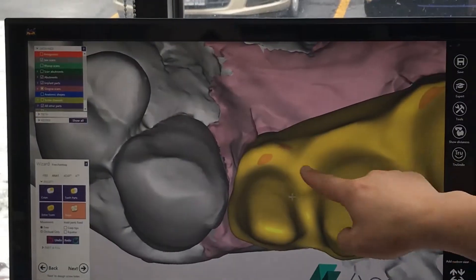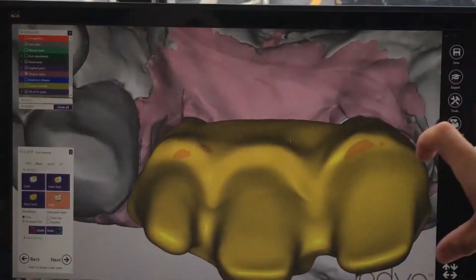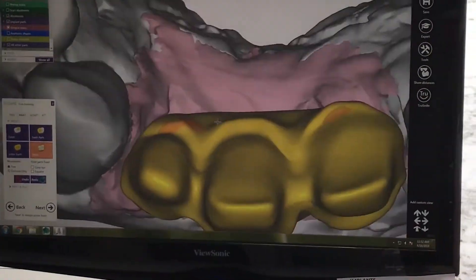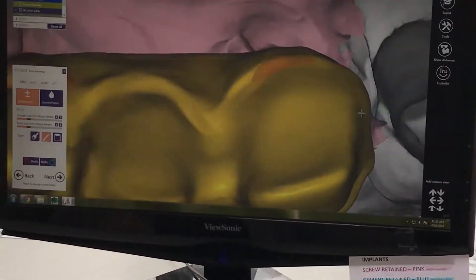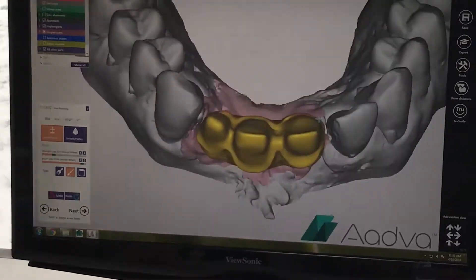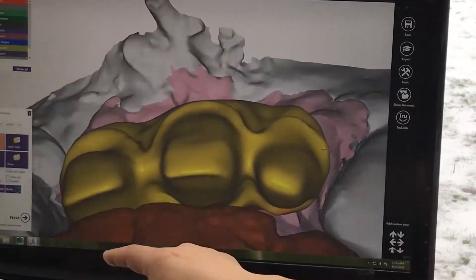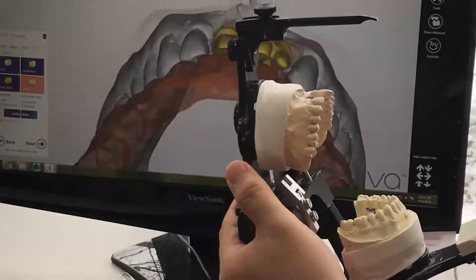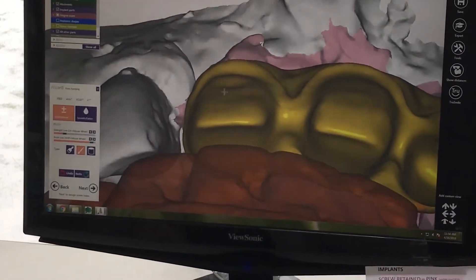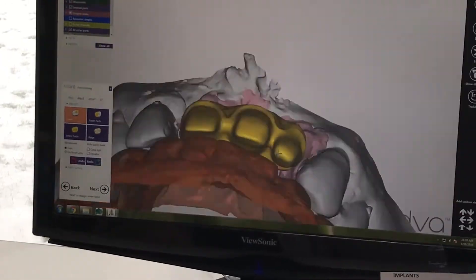After we mill the titanium minibar, we are going to make a PFM bridge with semi-precious metal copings. We make the lingual a little bit thin and refine the shoulder prep area. Then we flatten the gingival area. It is very important to check the occlusion. We cut it more facially because we need 2mm of room. Then we tighten the occlusion and make room for the bridge.